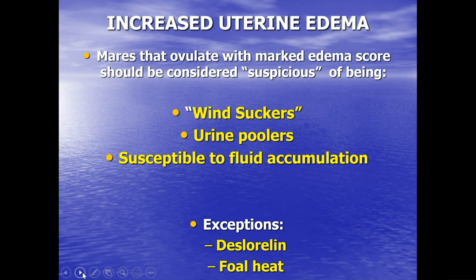And the same with foal heat mares, which is another story whether you should or shouldn't cover at day 9, 10, 11. But anyway, if you're breeding a mare at the foal heat, first estrus postpartum, don't sit around and wait for that edema to decrease ahead of expecting ovulation. Mares at the foal heat, in our experience, will quite often ovulate with a marked endometrial edema pattern.